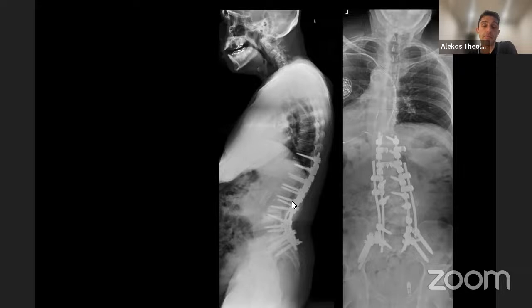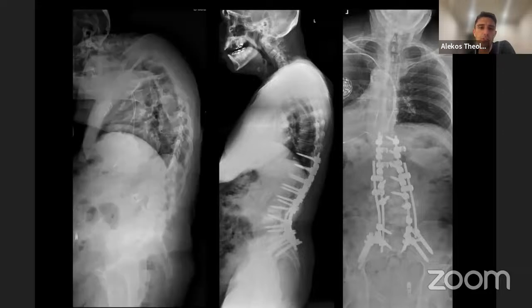So I thought it actually may stay the way it did, but for some reason it extended. And you can actually see I put these W connectors on the upper part of the thoracic spine in anticipation of needing to use those for the extension. So far he's not ready for the cervical spine, and I'm happy to wait until he's ready. But it's just an interesting effect on the cervical alignment after these deformity corrections.